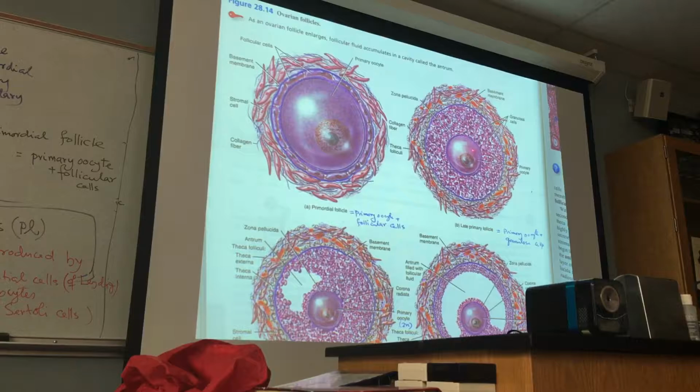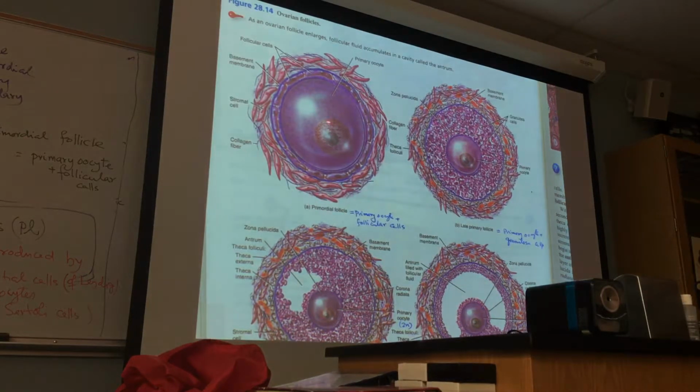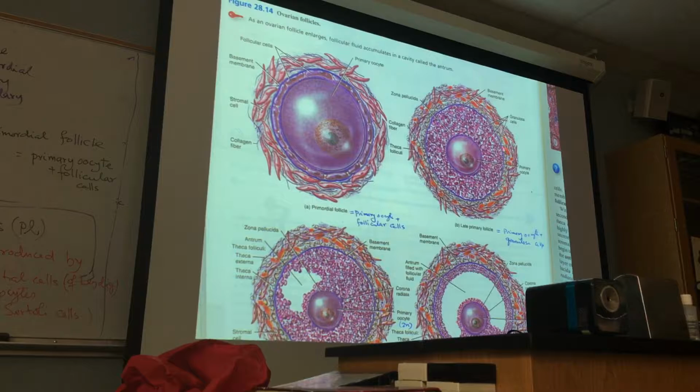Look. It doesn't mean that the primary oocyte becomes small. It also increases in size, but that increase is not apparent here, though definitely it increases.